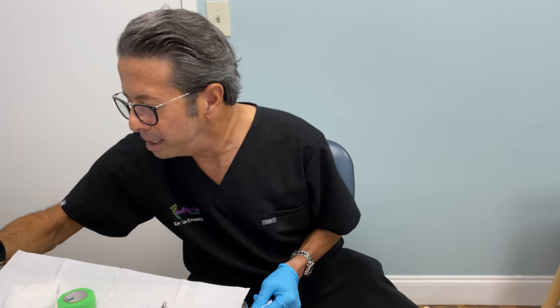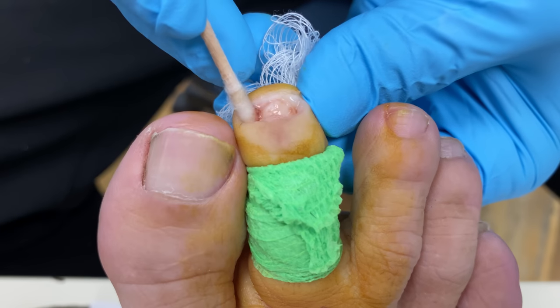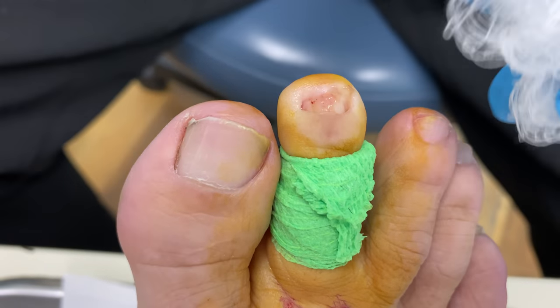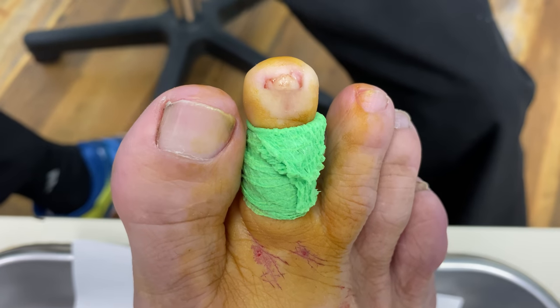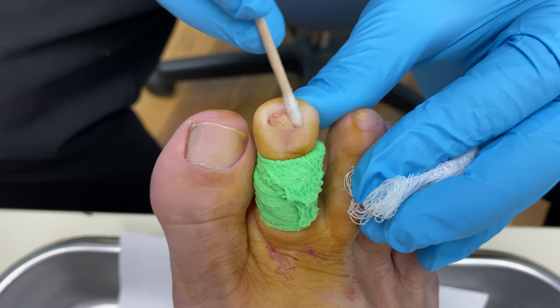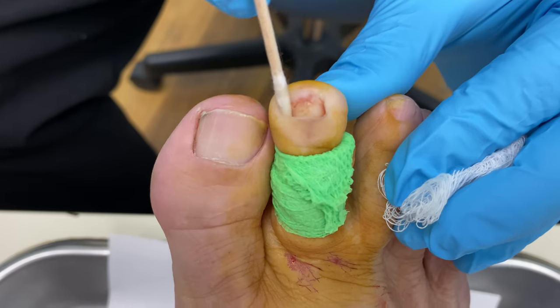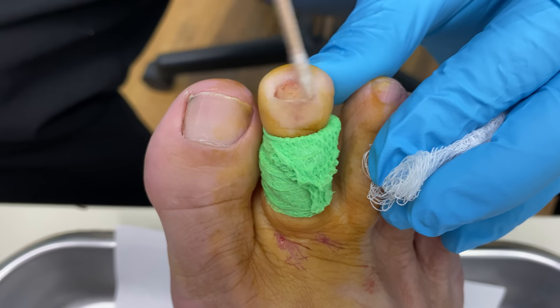So now we're going to kill the nail matrix. The nail matrix is the area where the nail grows from. So we're going to put this chemical right here under the eponychium and we're going to kill the nail matrix. I'm just kind of moving it around here — it's usually 10 seconds per stick. If you do too much, sometimes you get a little bit of a severe reaction to the chemical and it takes a little bit longer to heal. But this will heal pretty quickly.